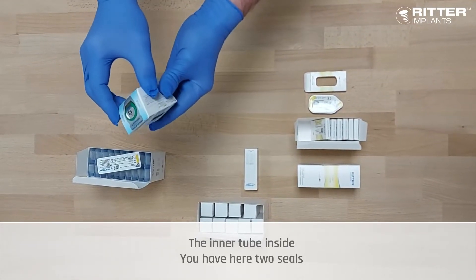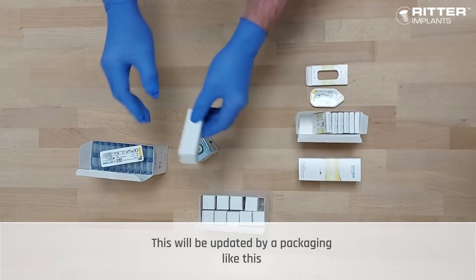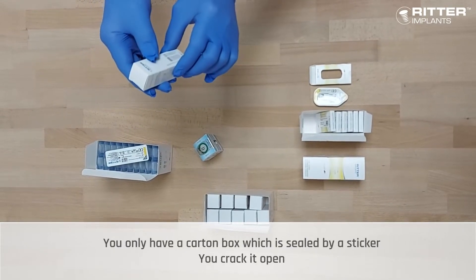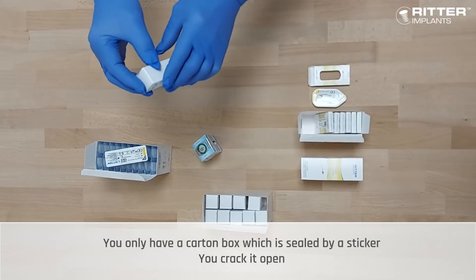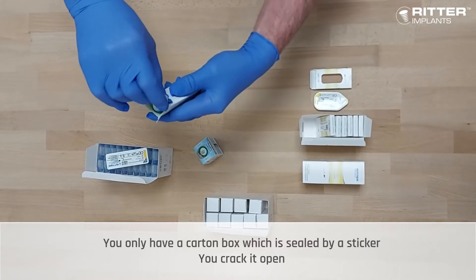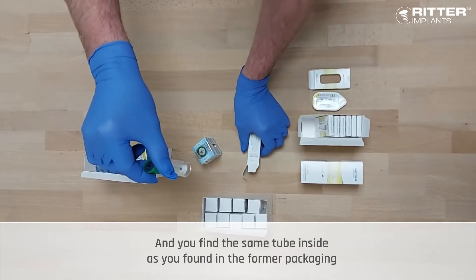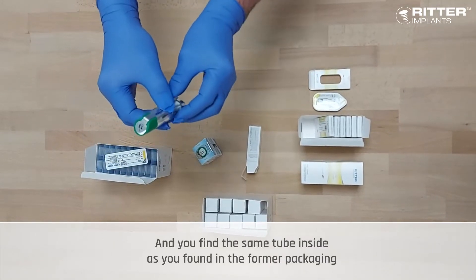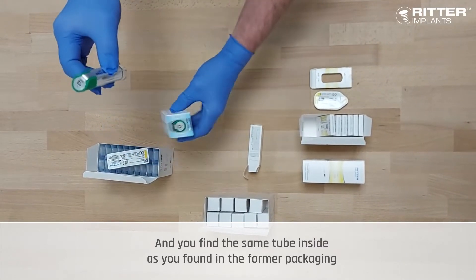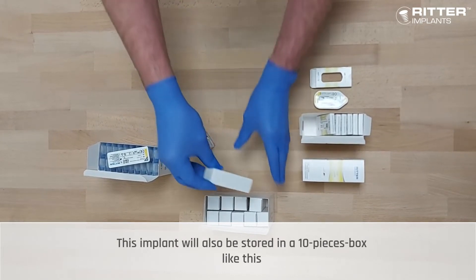This will be updated by a packaging like this — you have only a carton box, which is sealed by a sticker. Normally you crack it open if it's sealed by a sticker, and you find the same tube inside as you found in the former packaging.